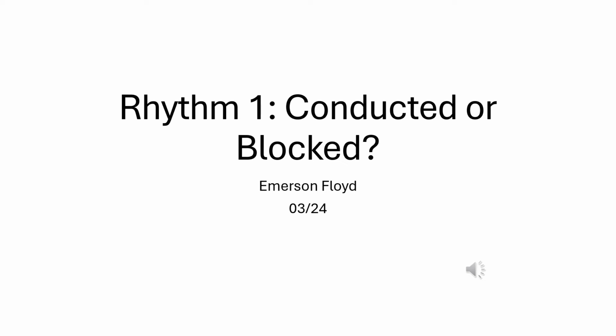Hi, I've made some videos to help you prepare for our upcoming session on bradycardias. This is the first one and will mainly deal with determining which P waves are conducted and which are not. Conduction issues may seem a bit dry, but they're at the heart of ECG interpretation.